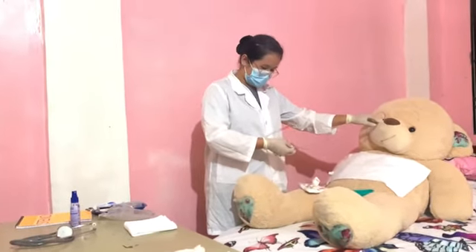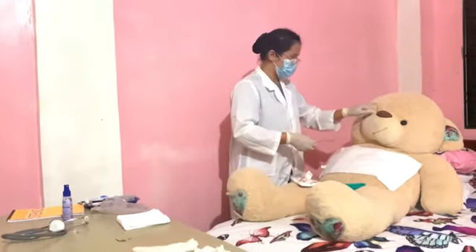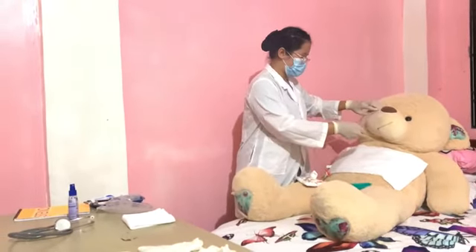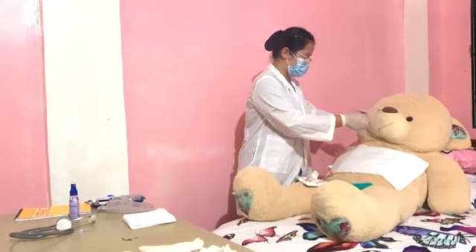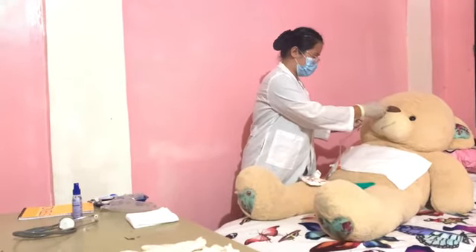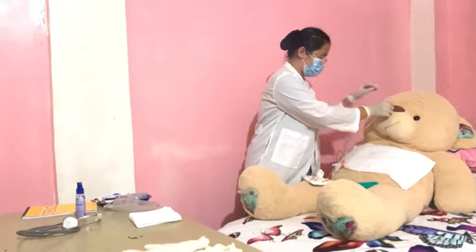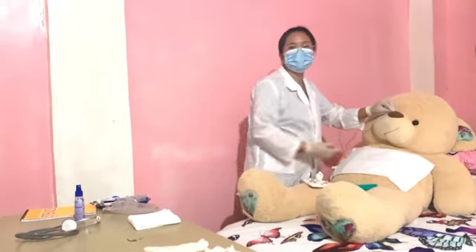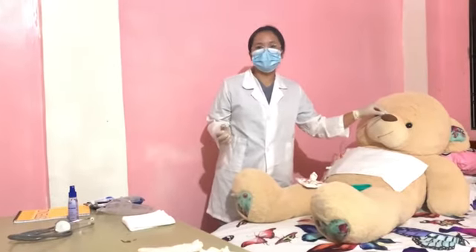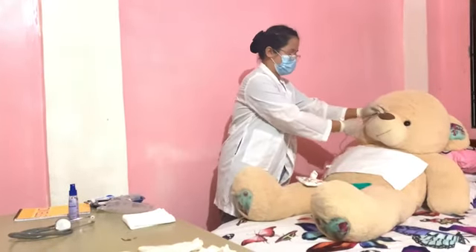So we have here our marking. Sige ma'am, swallow lang po. And then do not use force or rotate the tube if it meets resistance.